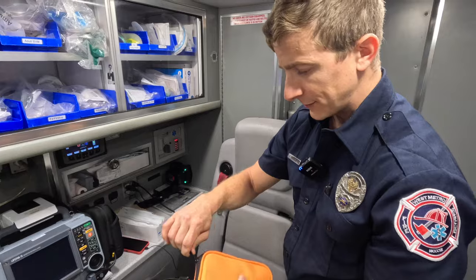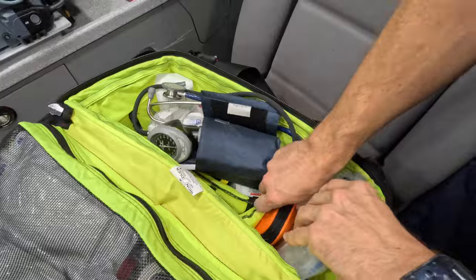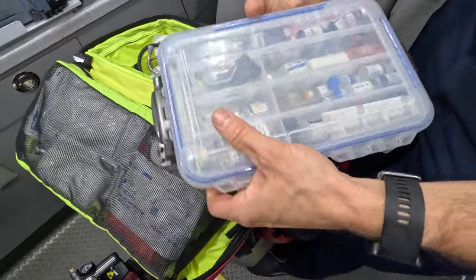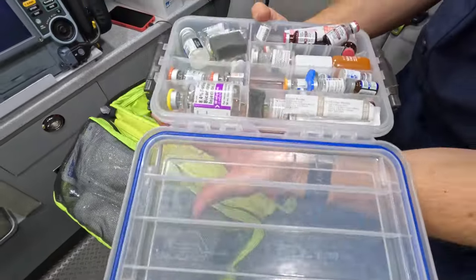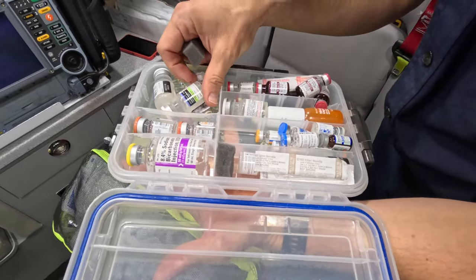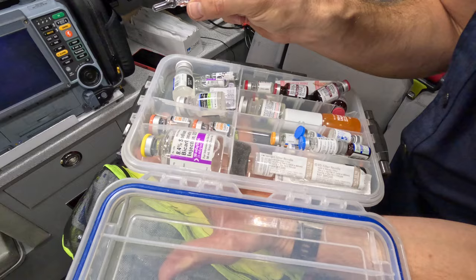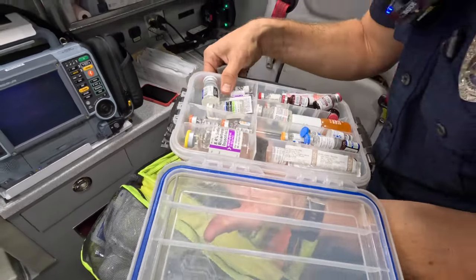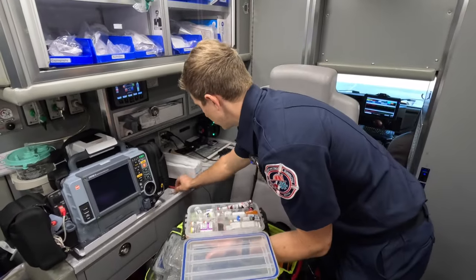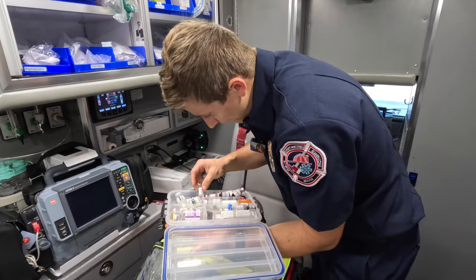Make sure our glucometer is stocked as well, and then we check through all our meds — adenosine, sodium bicarb, calcium gluconate, epi — checking expirations on here too. This one here is expired, so we pull it and replace it.